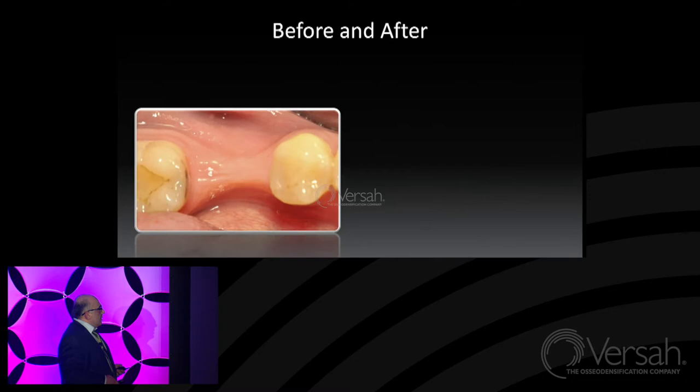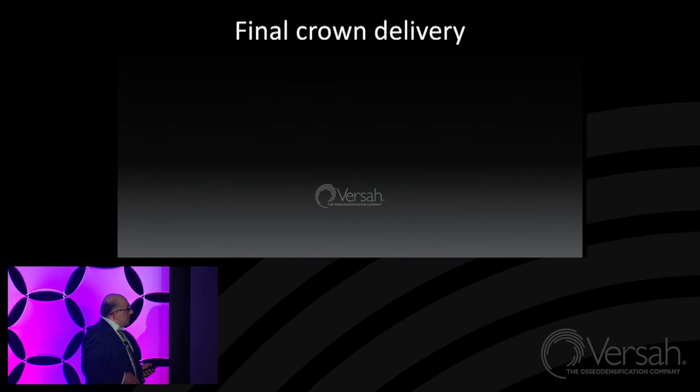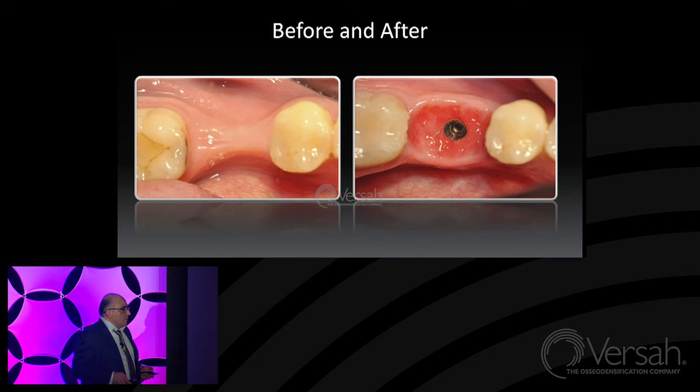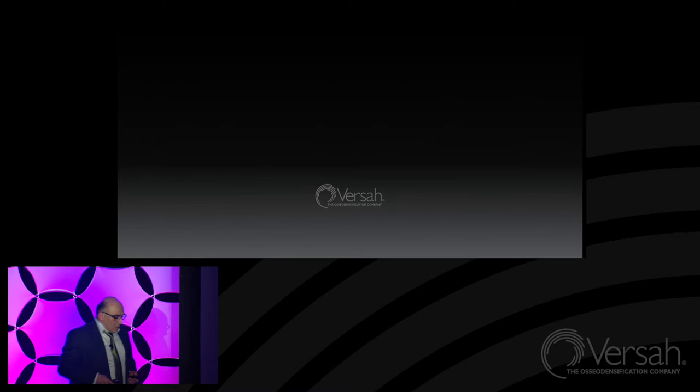And look at these two photos. This is before, and we have, once again, sorry. Here it is. Deficient alveolar ridge and creating new volume of hard and soft tissue. We do all these procedures without using osseodensification drills because we didn't have any idea about such a technique. After the fact that we got the new drills, we changed our approach.